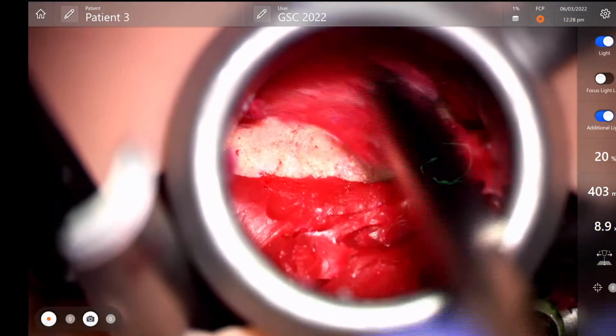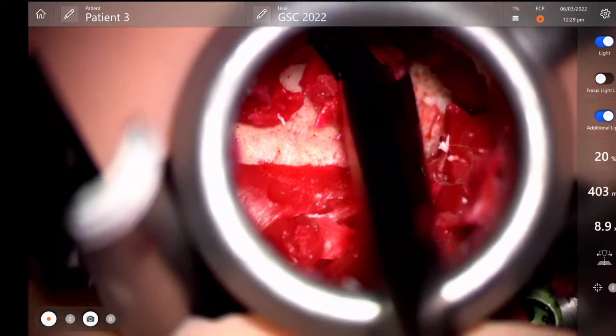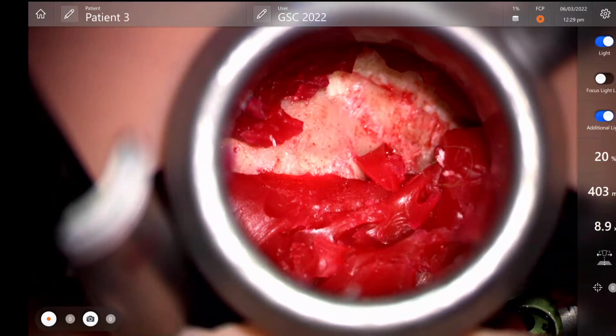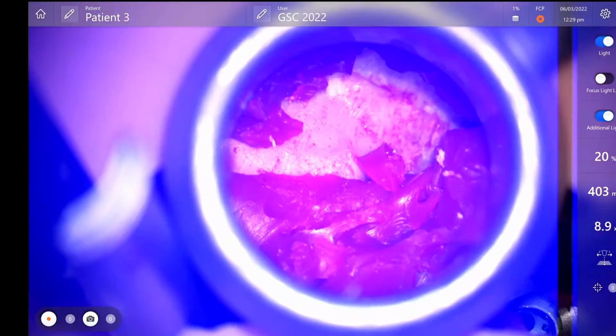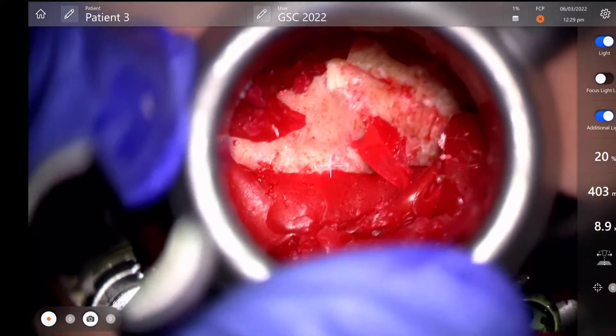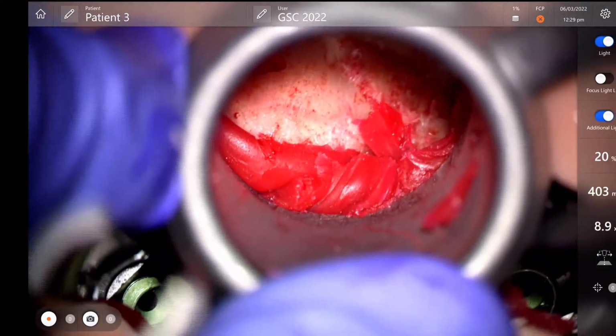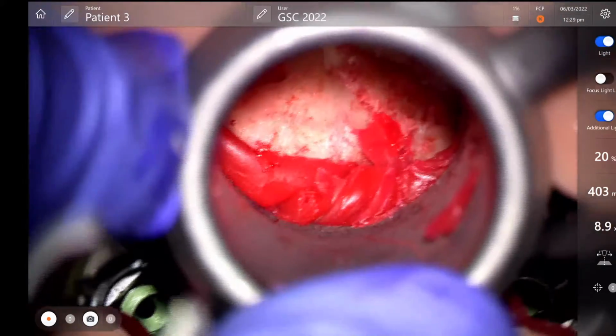Oh, I can see it through the microscope. So that's the inferior edge of the L4 lamina. That's really the structure that I want to get to. So can you loosen this again? I want to go a little bit more medial. Tighten it. And can we raise the table?